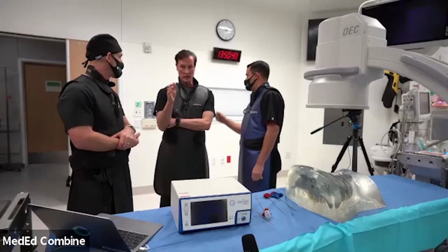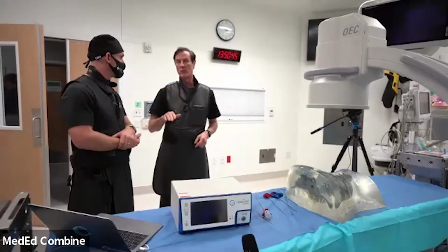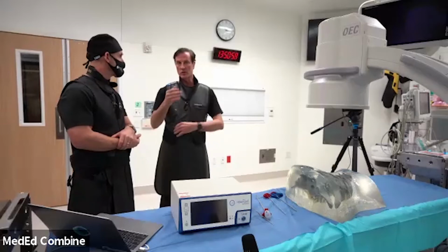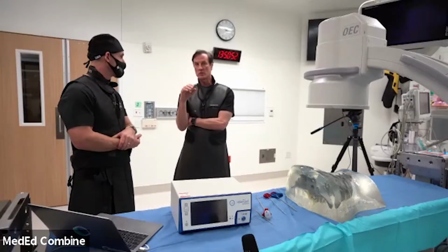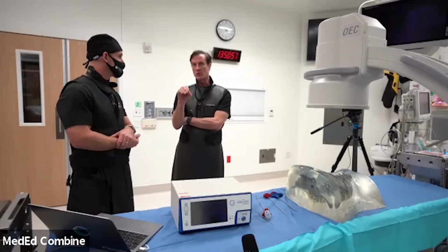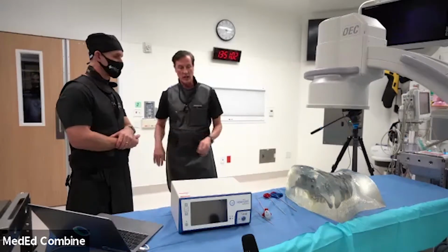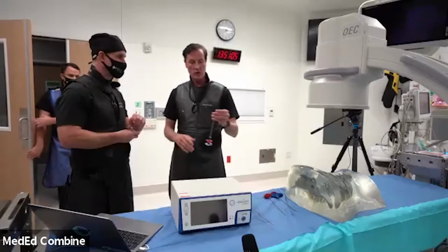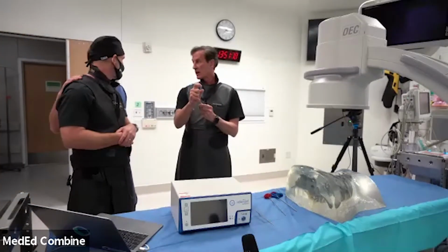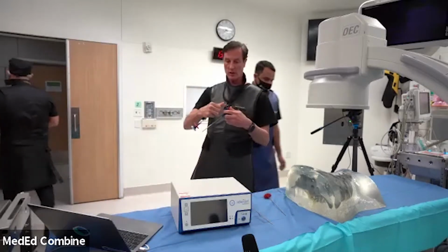So the nerve is located, as you mentioned, 60% of the way from front to back, plus or minus 10%, half the way up. And targeting that nerve is not easy. It's moderately difficult. So this is okay if you have to take a few passes, but be accurate, because you know that the more accurate you are, the better the success will be. And also, the nickel titanium stylet is curved. It's also beveled, so it exaggerates the steering capability. And the ability to get this through the needle, place your thumb and bend it up and turn it in like this.